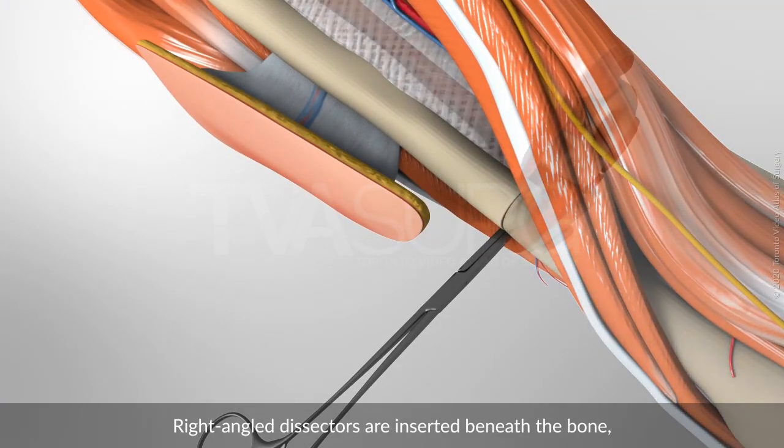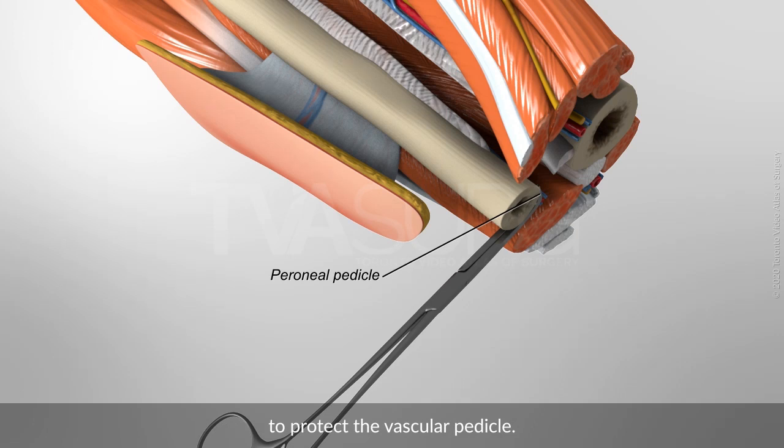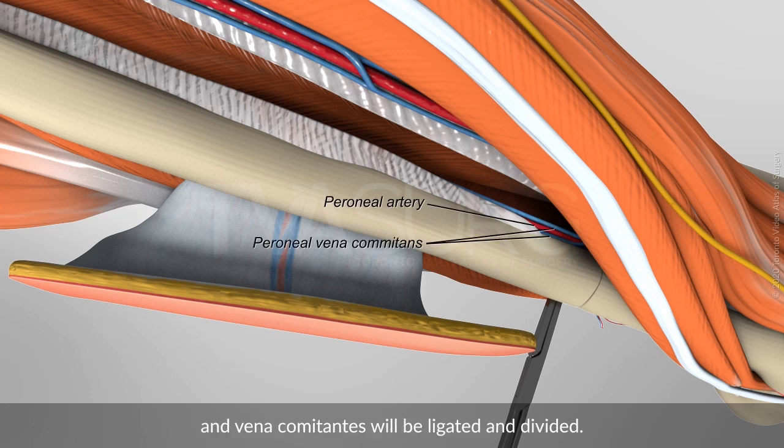Right angle dissectors are inserted beneath the bone. To protect the vascular pedicle at the distal end of the exposure, the peroneal artery and vena comitans will be ligated and divided.